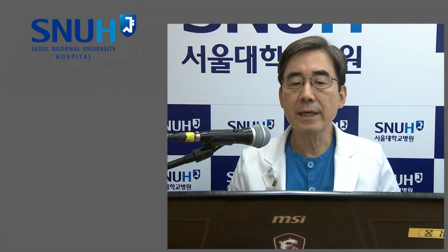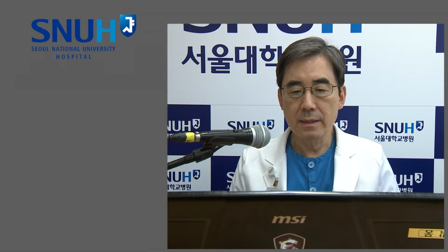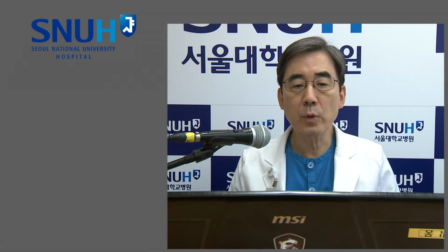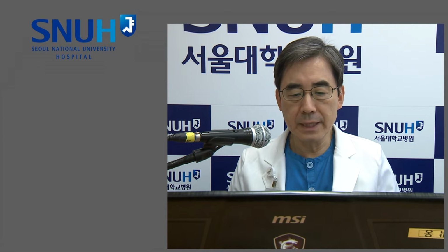The second case will be TAVR in TAVR. The CoreValve failed, thus I prepared a Sapien to treat the failed CoreValve. The third case is reversed: a failed Sapien case, and I'm going to treat her with Evolut Pro. Now I'm playing the first recorded case.